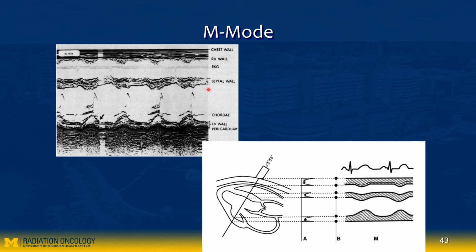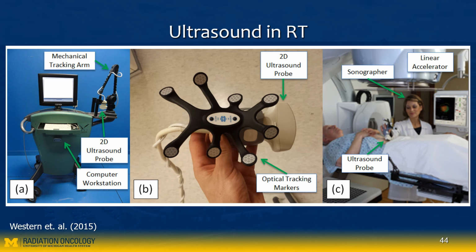So you can kind of tell, I mean, I cannot, but an expert can tell there's abnormality in the valve opening and closing and that sort of thing.